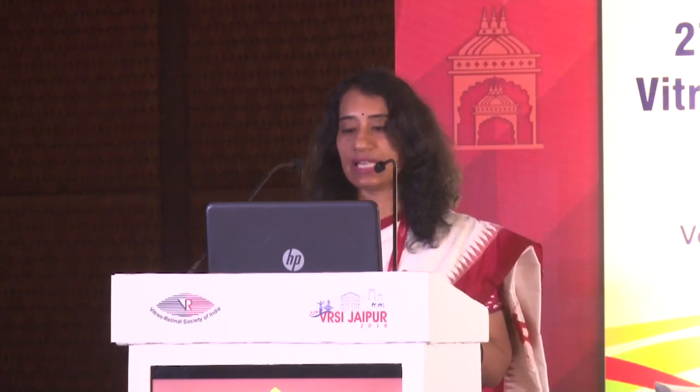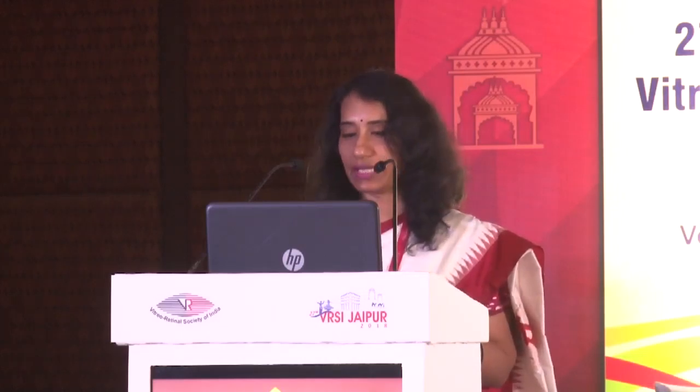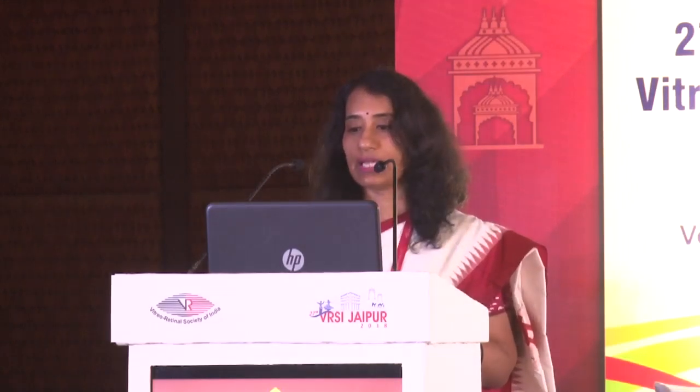And you have a delay. This is a left eye AZOOR patient, and you can see that in the left eye, the EOG light rise is very much reduced, and the 30 hertz flicker is also delayed. And siderosis bulbi, again, you have electronegative ERG and a flat ERG.